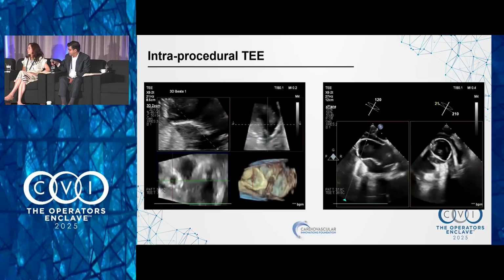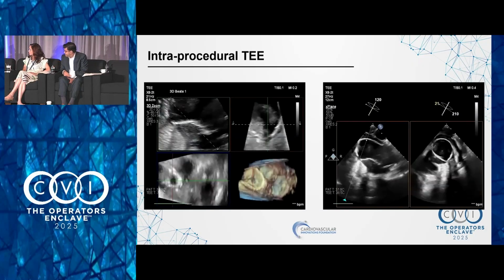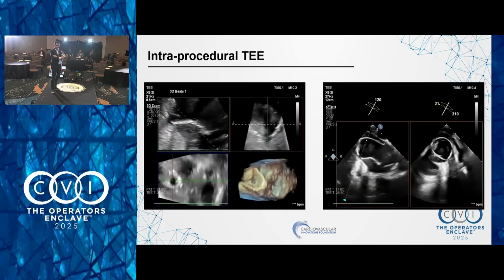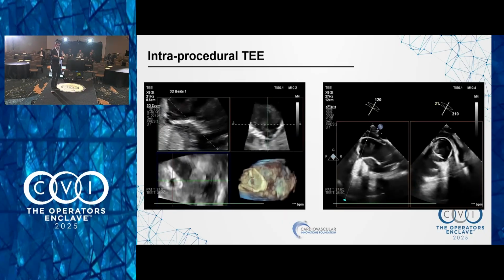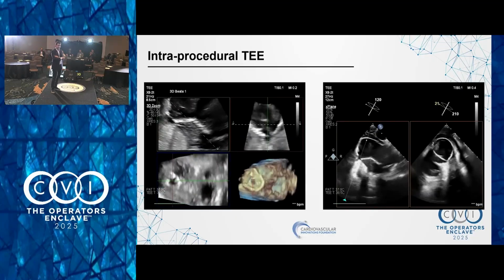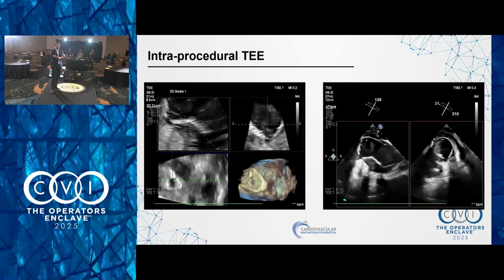Yeah. And I'm just thinking about this for a total of 20 seconds, so it's probably all wrong, but I would worry a little bit that unless you perfectly cover the entry into the pseudo, you would leak through the right. So I would do what these guys said, but I'd do it with a covered stent.